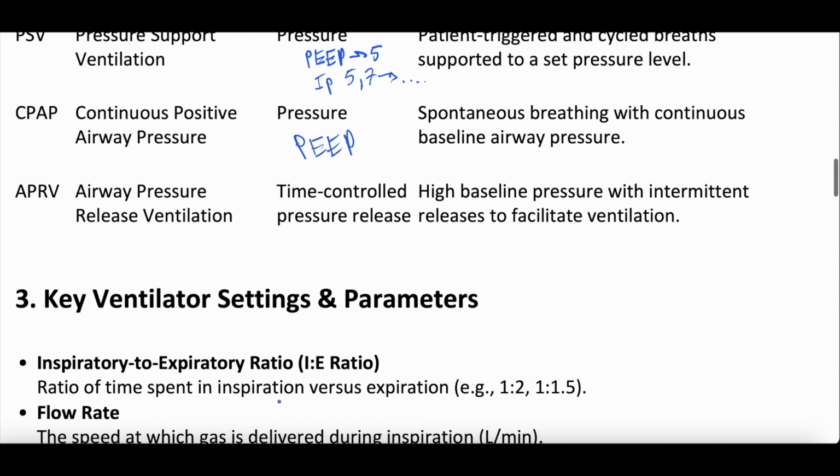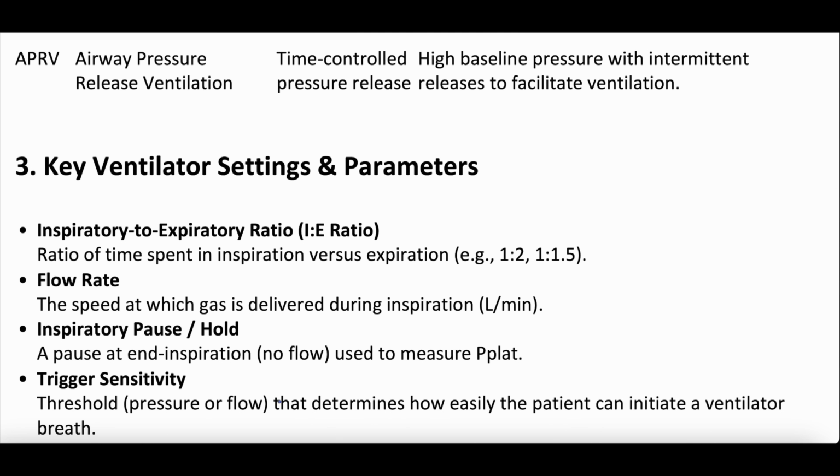All right. Ooh, APRV. This is really complex. We have a whole episode we're putting out on APRV. It will be already out by the time this episode debuts. We suggest you just check out that episode because this is going to be too hard to explain quickly. It stands for Airway Pressure Release Ventilation, and it's essentially a time-controlled high pressure with intermittent pressure releases to facilitate ventilation. But that probably doesn't make sense when I just speak it that way. So definitely check out that episode if you have an interest.